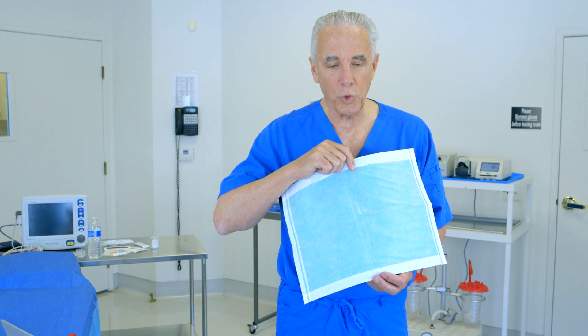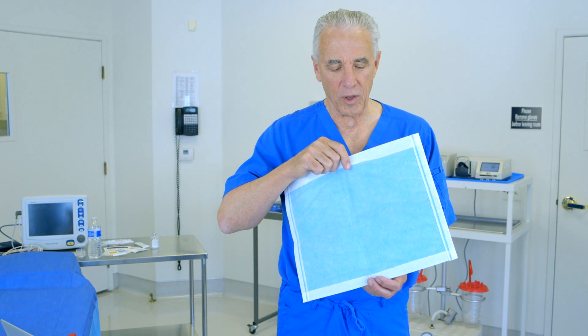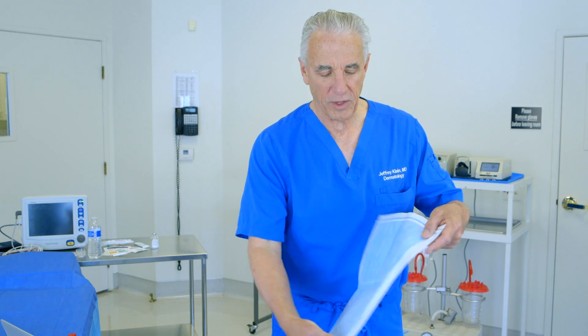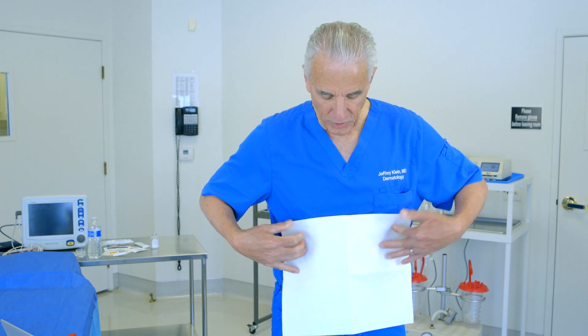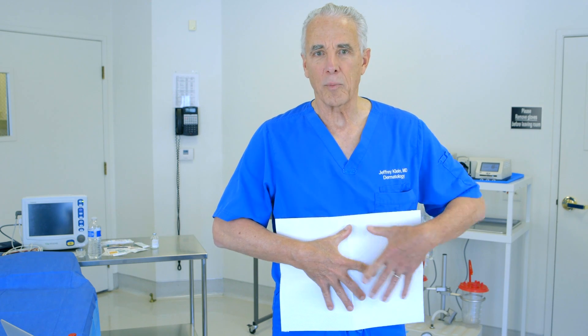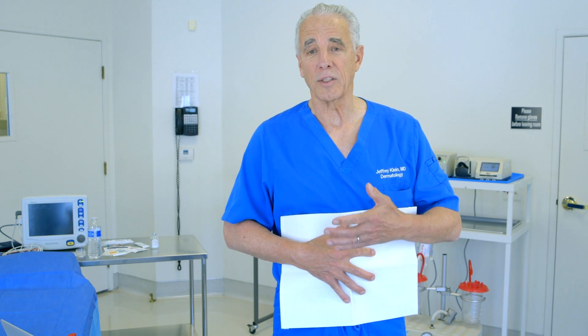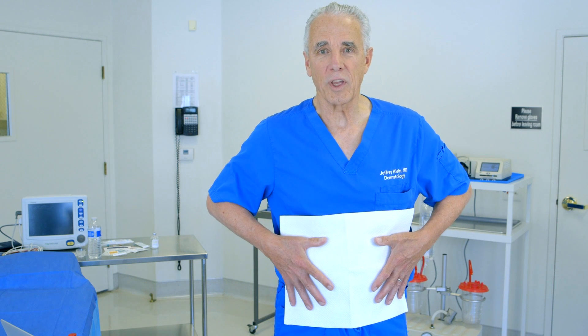We also utilize other devices. We will, for example, take this pad after liposuction and put it on the patient's abdomen, and then apply some tube netting on top of that to hold it in place temporarily. On top of that, we'll apply a spandex compression garment that holds everything in place.